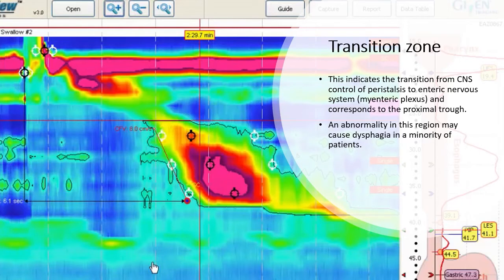The transition zone indicates the transition from the central nervous system control of peristalsis to the enteric nervous system, which is the myenteric plexus, and corresponds to the proximal trough. An abnormality in this region may cause dysphagia in a minority of patients.